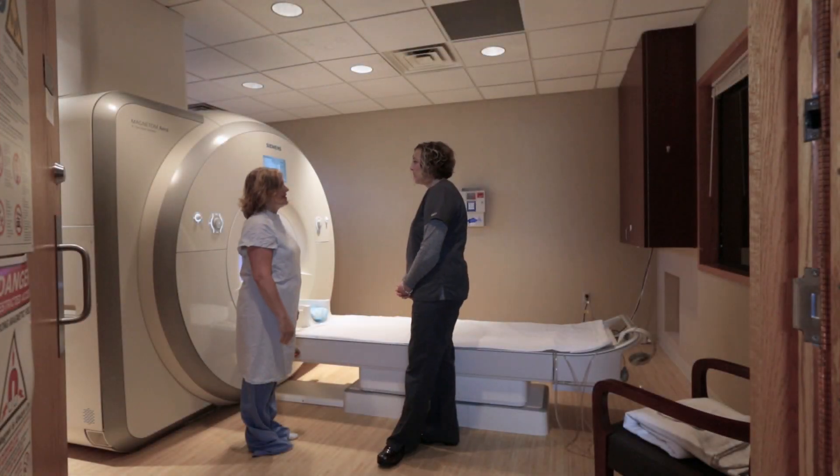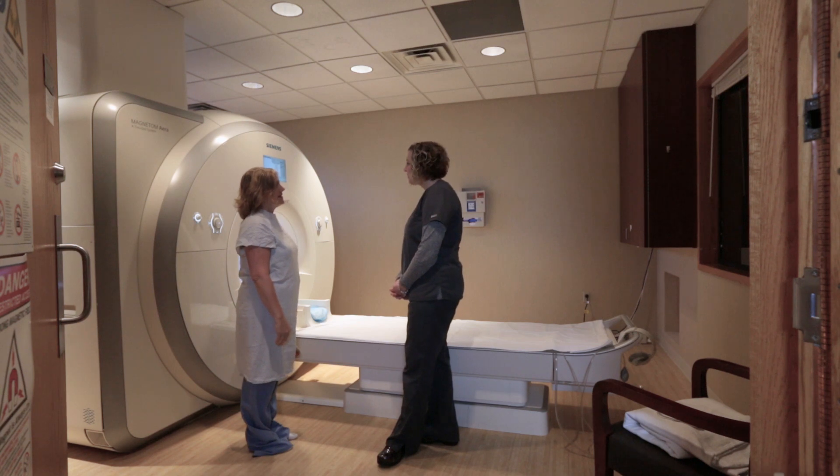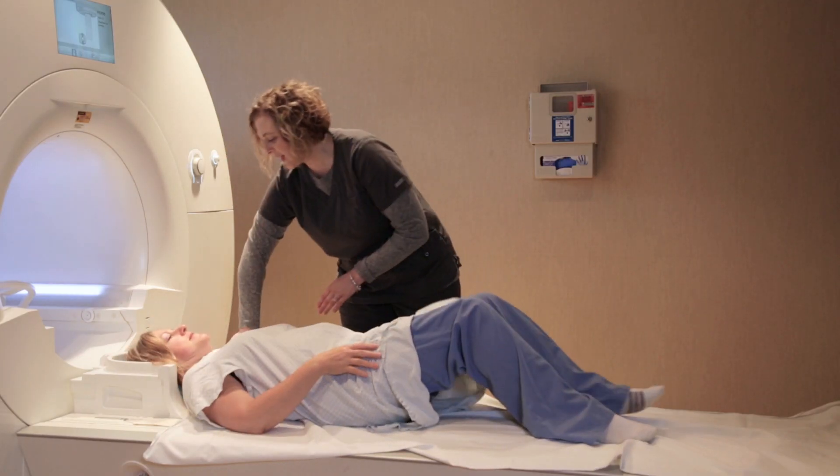Not every exam is the same. It's very specialized to the procedure that you're having and the type of coil that we might be using.